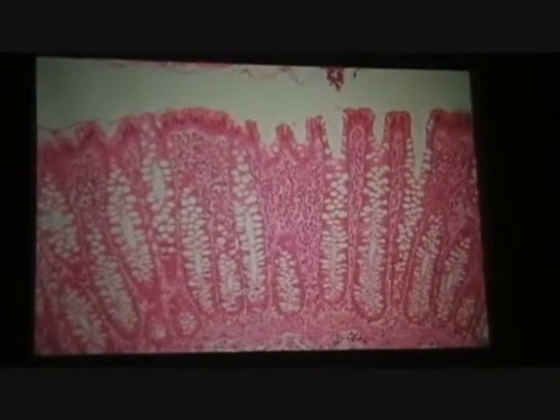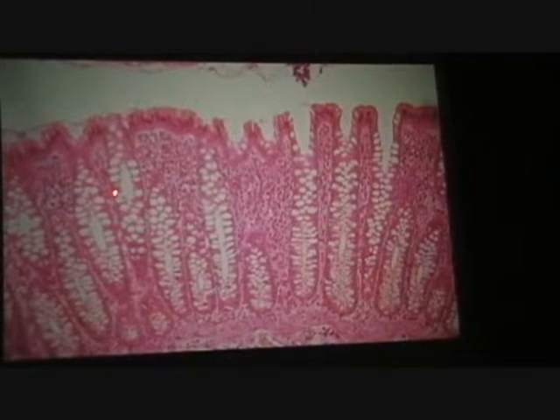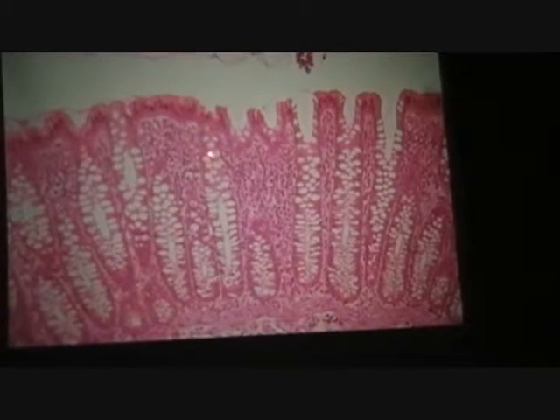And then you start thinking, do I see stratified squamous? Do I see villi? Gastric pits? Do I see goblet cells and crypts? You know, these primary structures that you know well by now. What am I seeing here? I think the one thing that should jump out at you would be these bubbles. See them? What are those?